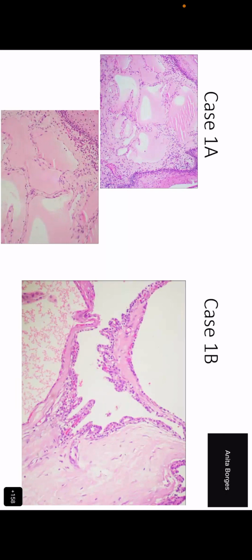Which suggests, Suweta, that if something is continuous, it must be an epithelium. Is that what you believe, Suweta? No, ma'am. Epithelium can also be discontinuous. Which epithelium is discontinuous, Suweta? If there's ulceration. But do you think this is an ulcerated epithelium or something?